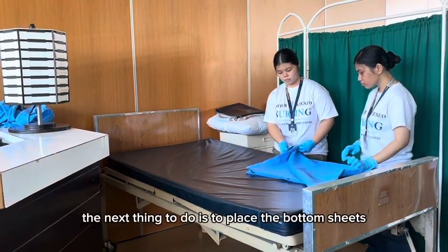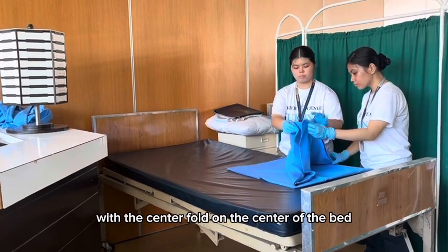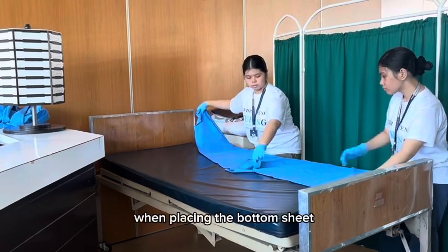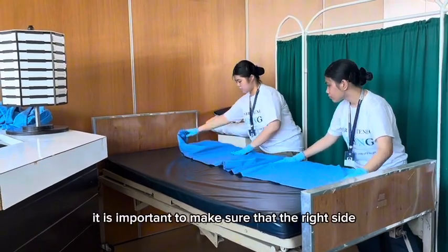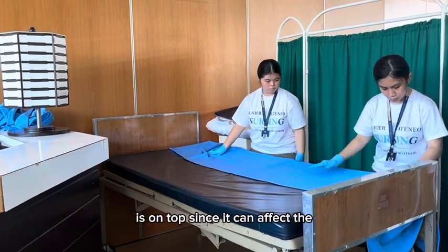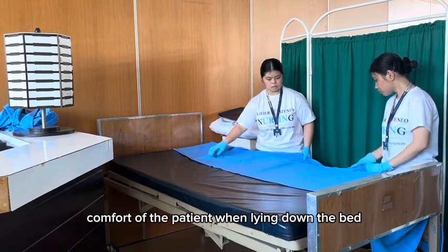The next thing to do is to place the bottom sheet with its center fold on the center of the bed and fan fold half of the sheet towards the bed. When placing the bottom sheet, it is important to make sure that the right side is on top, since it can affect the comfort of the patient when lying down on the bed.